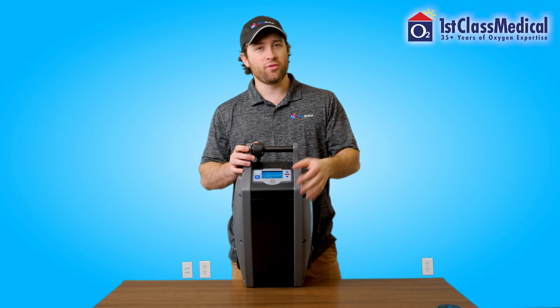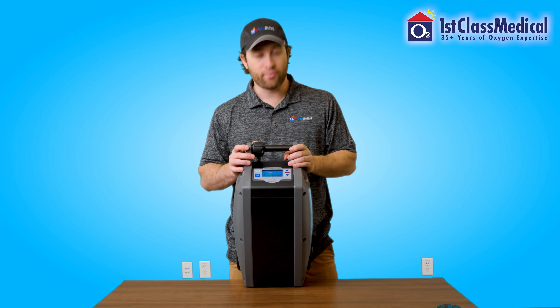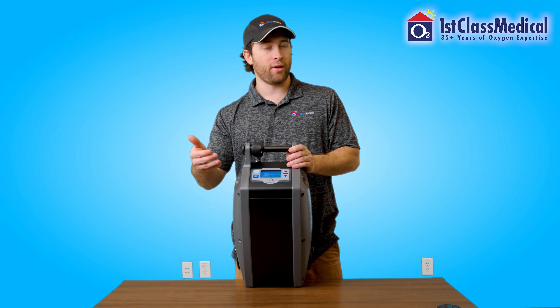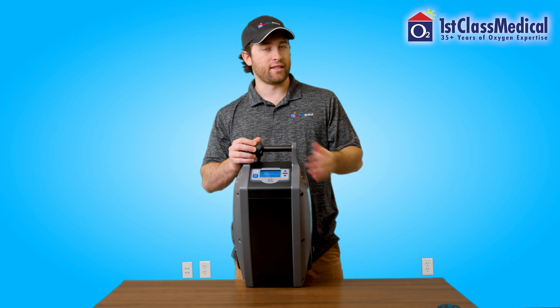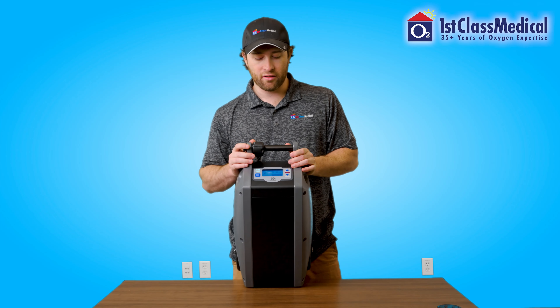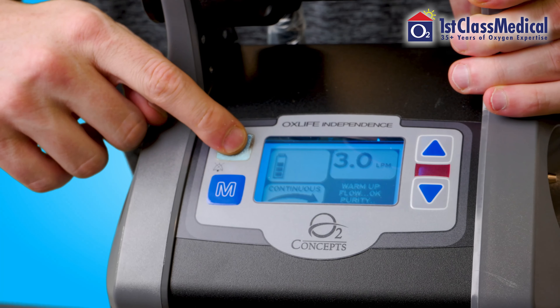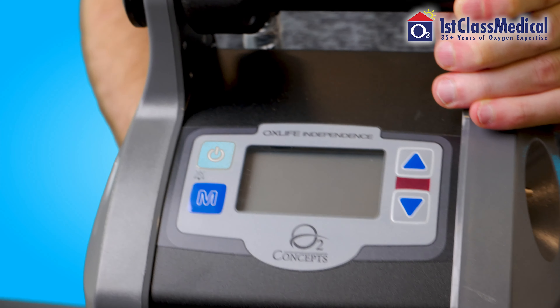It's very simple to use, as you can see. The main things you want to pay attention to are the flow rate and the setting. To power this unit off is very simple — just hold that power button for a couple seconds and the screen and unit will go off.